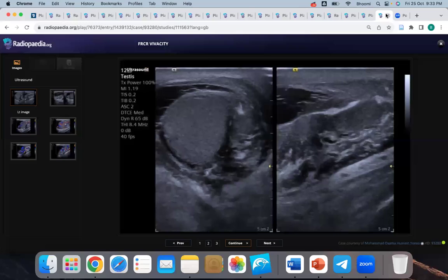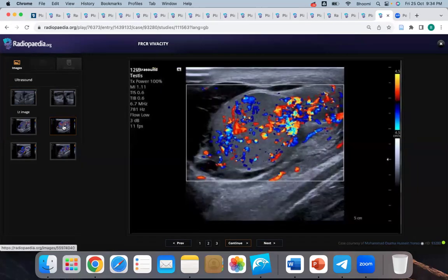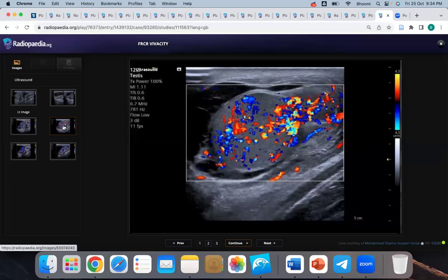This is a testicular ultrasound. There is peritesticular fluid and thickening of the tunica albuginea. On Doppler images, there is intact vascularity inside the testicle. Comparing both sides, in the presence of good vascularity I would favor epididymo-orchitis rather than torsion. I will refer to the urology team for antibiotic treatment and clinical follow-up.